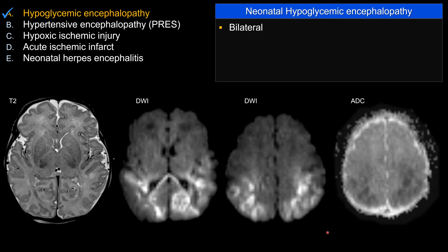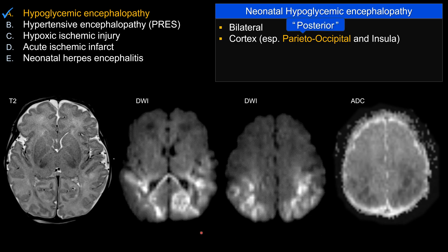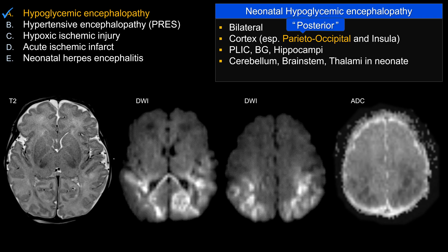The involvement is bilateral, and the cortical involvement tends to be parietal occipital lobe, posterior temporal lobe, and insula — in other words, posterior distribution, like in this case. Notice the sparing of the anterior aspect, the frontal lobe. The posterior internal capsule, basal ganglia, and hippocampi can also be involved.